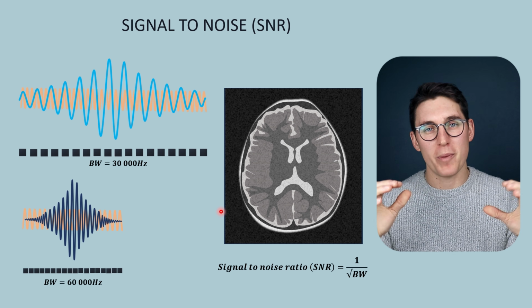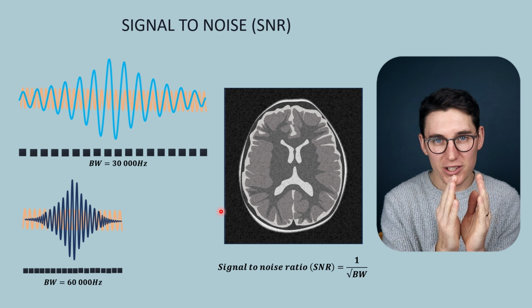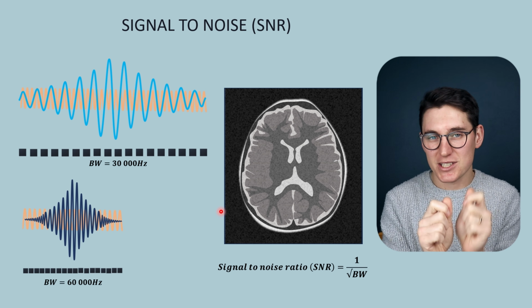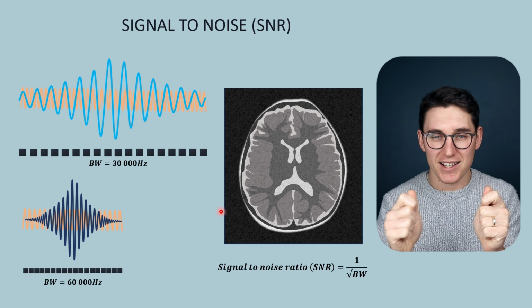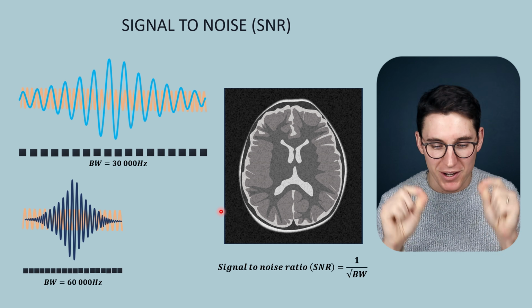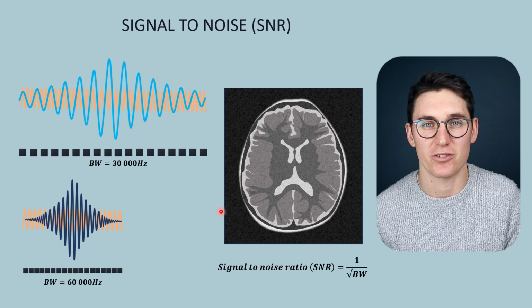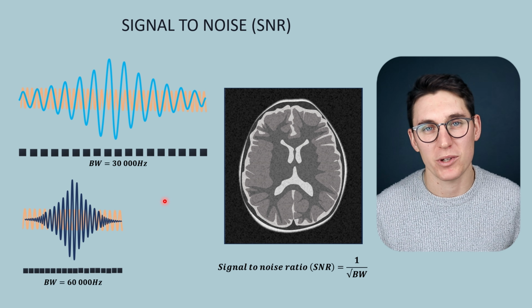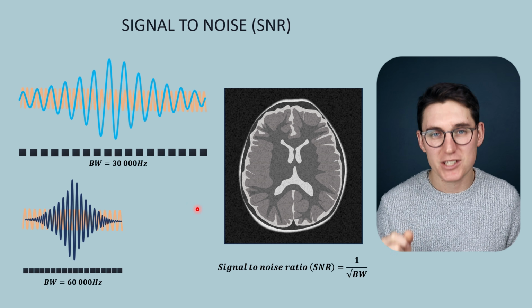When we have a narrow bandwidth, a low range of frequencies, each pixel represents only a very small change in frequency value. And because of those differences in fat and water, we will start to misrepresent where water and where fat lie on the x-axis. Now, don't worry about getting into this. We're going to dedicate a whole talk to looking at the chemical shift artifact. It also turns out that the lower or the narrower our bandwidth, the worse that metal artifact is within our image. So it comes as a trade-off.